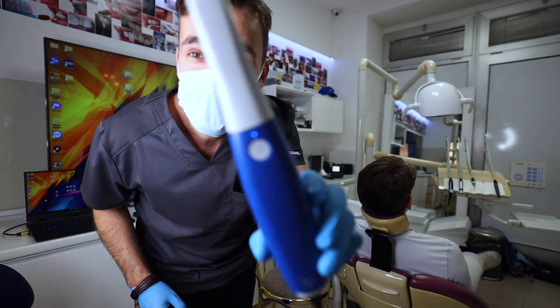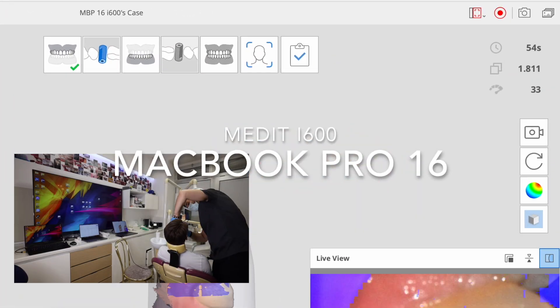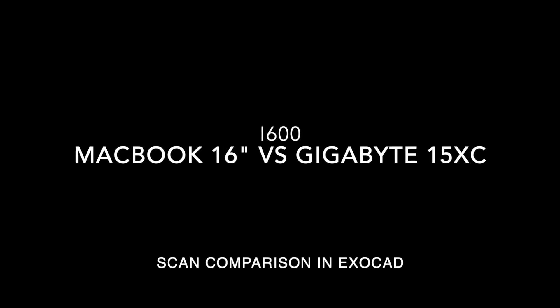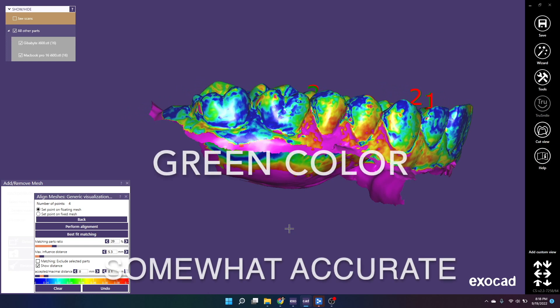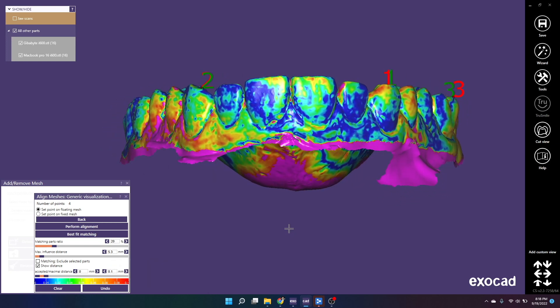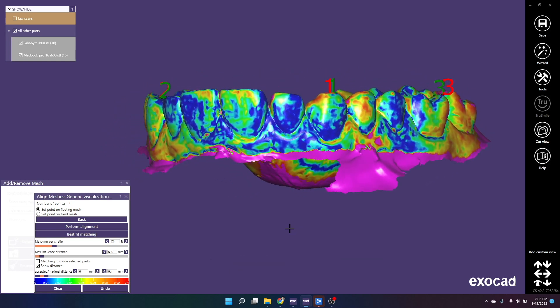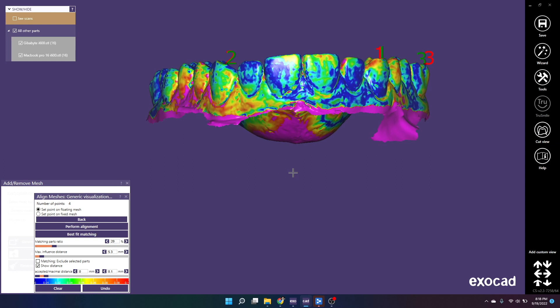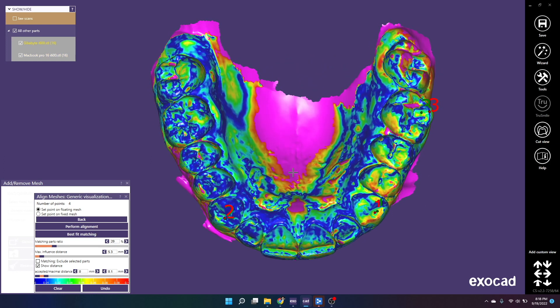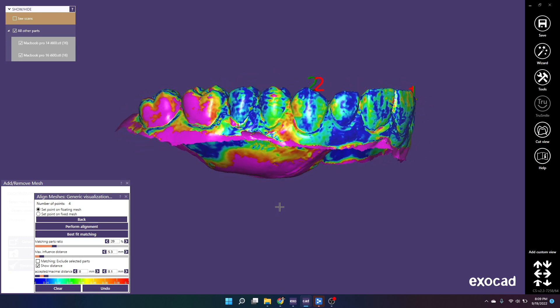The final test: i600 and MacBook Pro 16-inch.